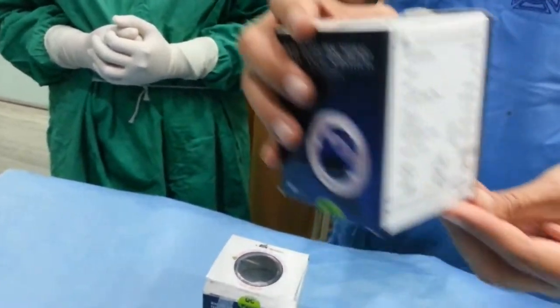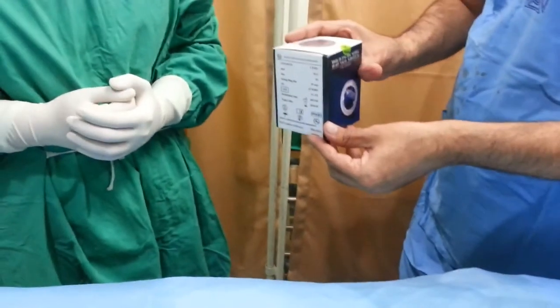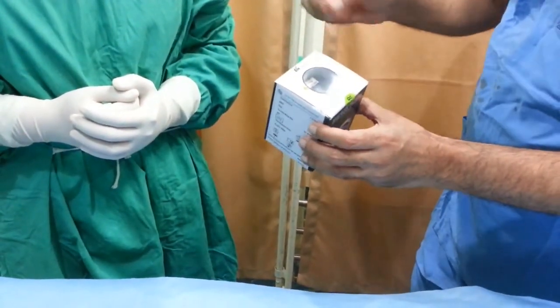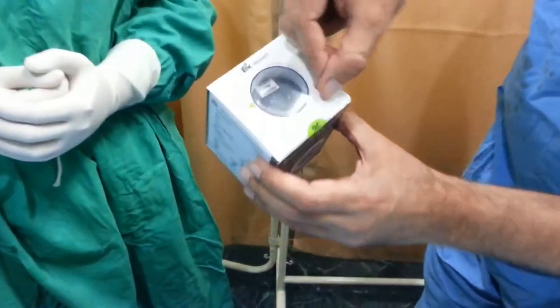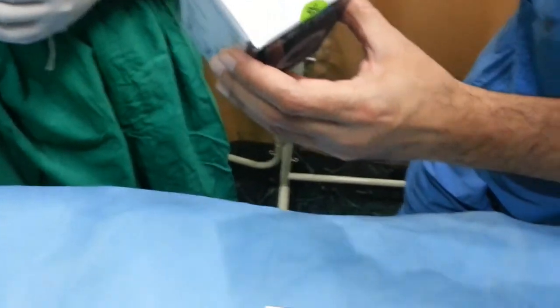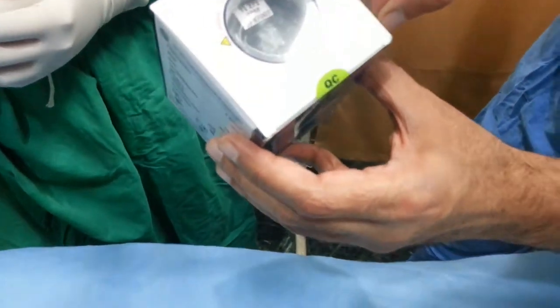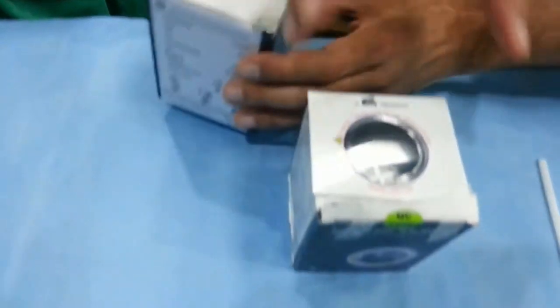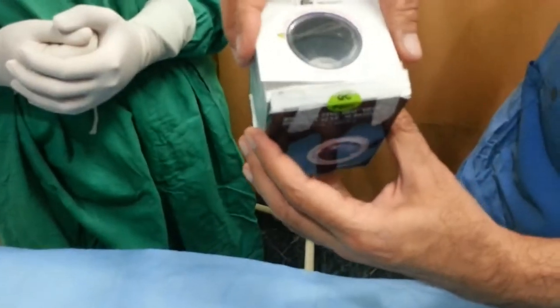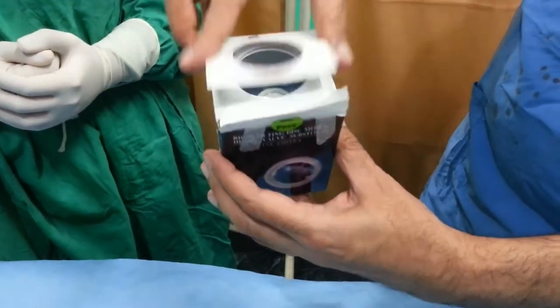She goes around and then goes towards the scrub nurse. When she goes to the scrub nurse with this valve, she decides with a knife to open this line. There is a cut open line. Okay, she takes a knife blade and cuts along this line. When she cuts it along this line, we get this situation. The valve box opens. She should hold this box exactly like this.